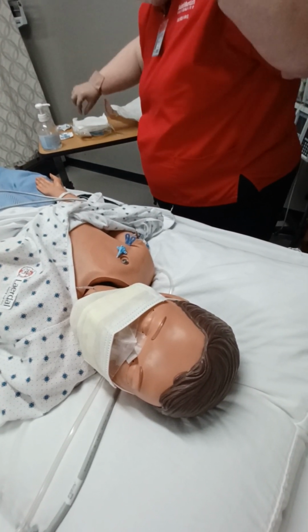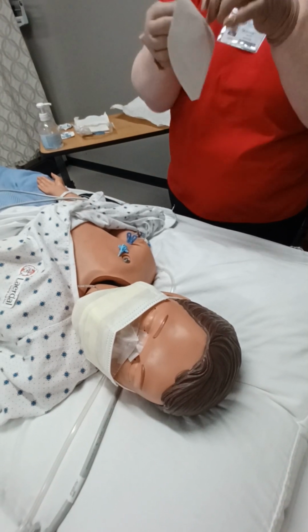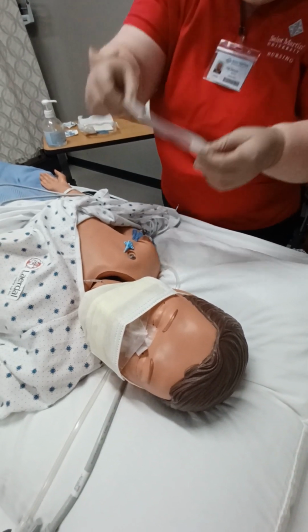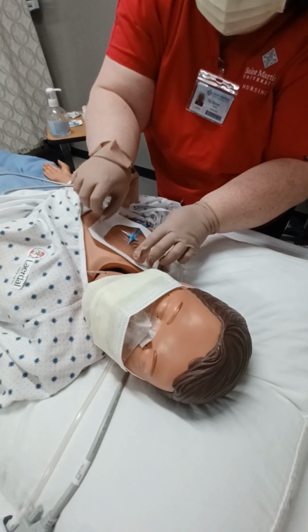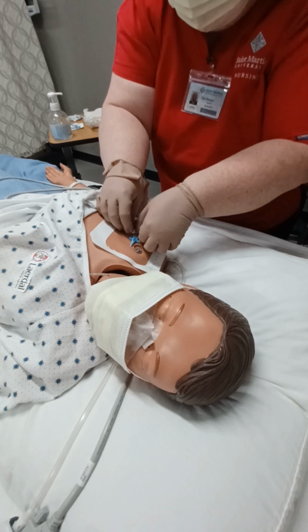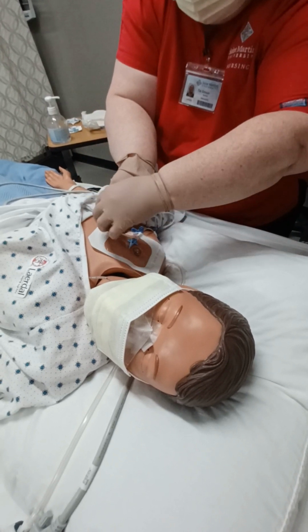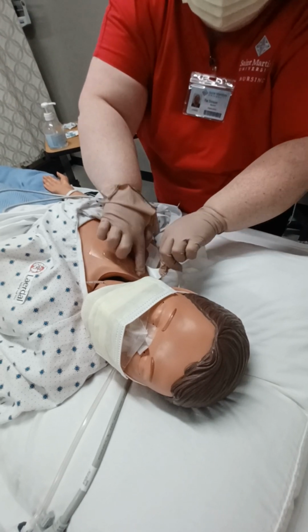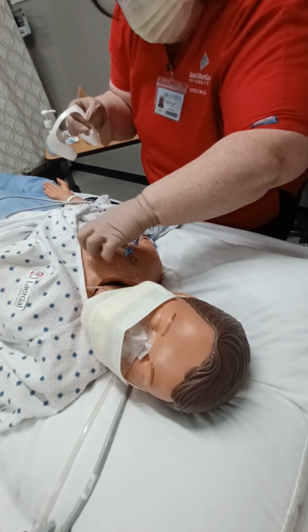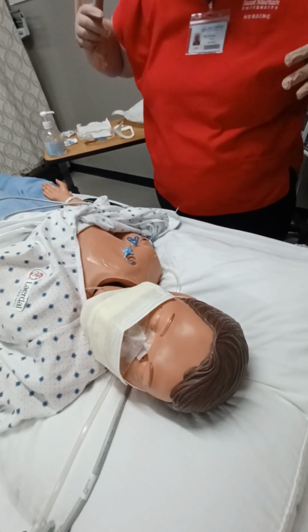Garbage. Okay. Gonna grab that guy. Peel that off, throw it away. Gonna place this new one over the top. Make sure that the seal around the new seal is good. Tear the strip away. Make sure that that new one adheres all the way around, that we get a good seal all the way around it. Perfect. I'm going to hold on to that because I do need that. Okay.